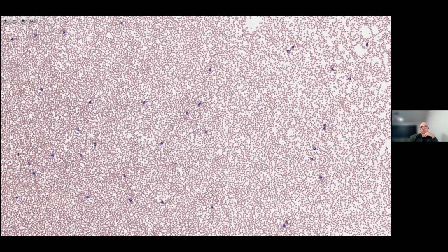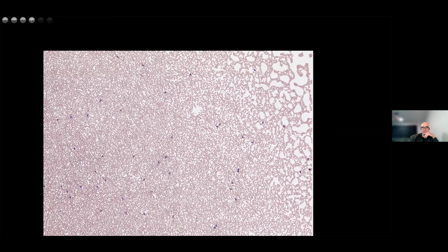So then you would want to look for the ideal area of thickness, or monolayer, on the blood film. Start from the feathered tail end of the blood film and work your way thicker to the body of the blood film. Start where you see the red cells begin to overlap, but are still uniformly distributed. And you'll zoom in a little bit or go to a higher powered objective and start having a scan about to see what you're working with.